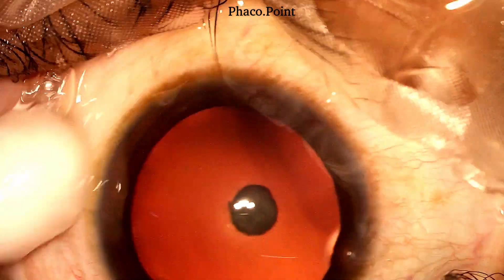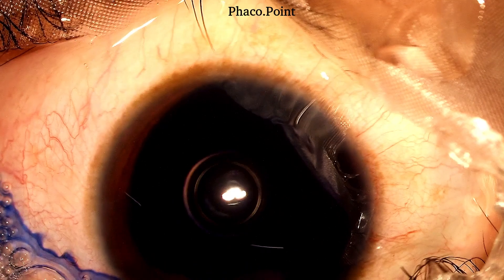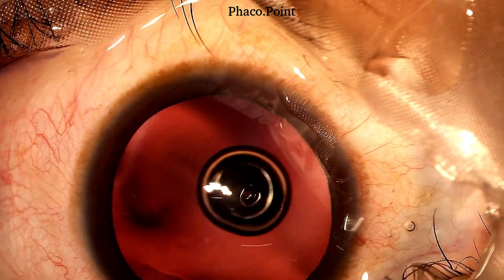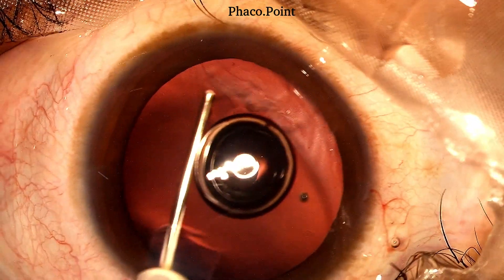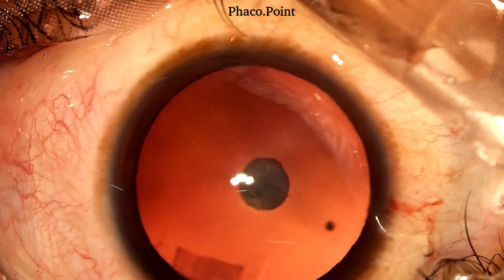The next step — the introduction of blue dye to stain the anterior capsule — should be done gently. Washing out of the blue dye should also be a gentle procedure. We then introduce some viscoelastic slowly to deepen and maintain the anterior chamber for the capsulorhexis.